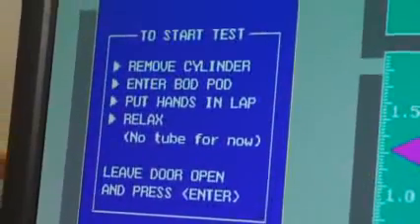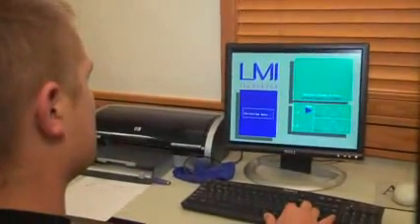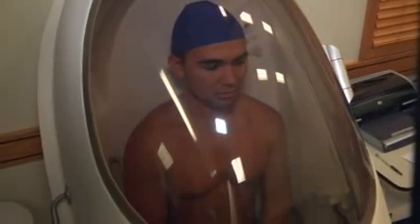The program will then have you calibrate the Bod Pod chamber by inserting the cylinder. After this, it will instruct you to have the subject enter the Bod Pod. Remember to tell your participant that if they feel unsafe at any time, there is an emergency shutoff inside the chamber. The program will run two to three tests to ensure accurate results. To increase consistency, have the subject relax and hold still, as too much movement can cause errors in the results.